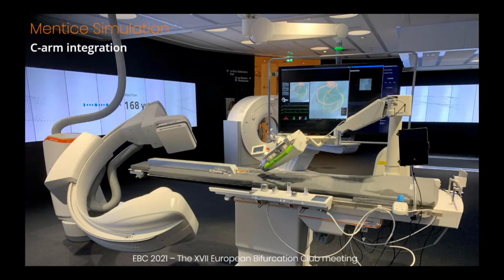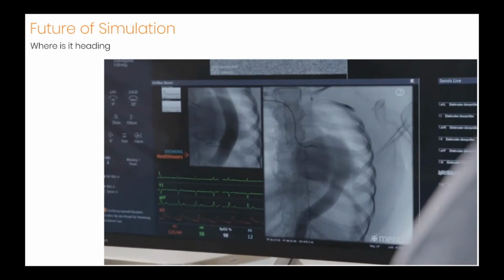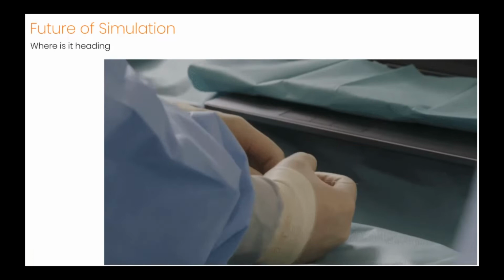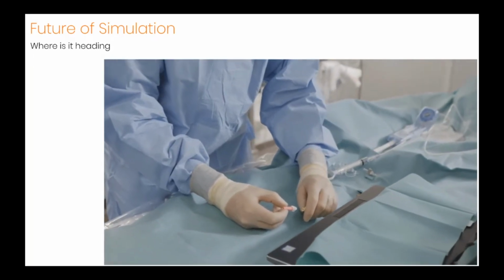What if next to your patient fluoro screen, you also have a simulation screen that showed the virtual twin of that patient with the same anatomy, same pathology, and as you move with your devices inside the patient, the simulation follows along automatically. At first, simulation could be used to practice certain steps before you do them, perhaps help you find optimal angles for your C-arm or hint at areas that might need a closer inspection.